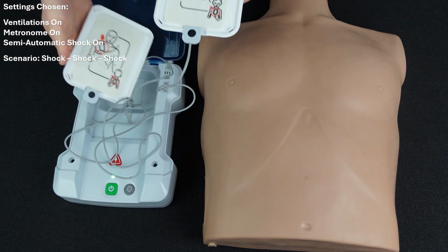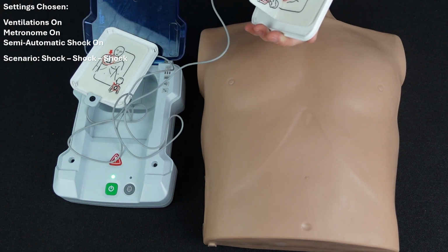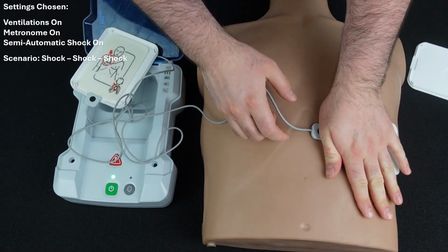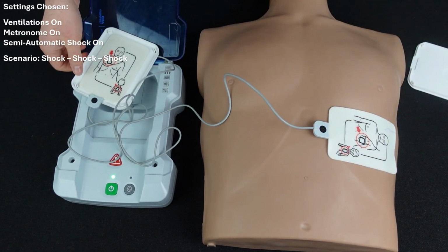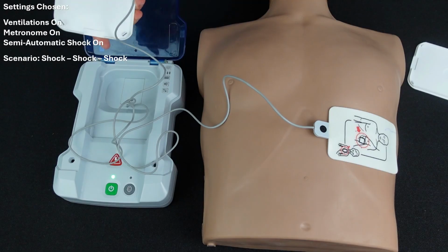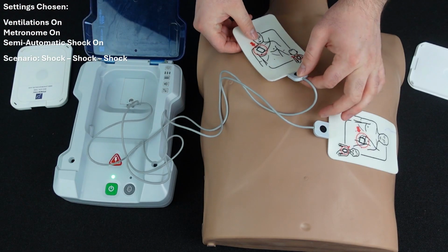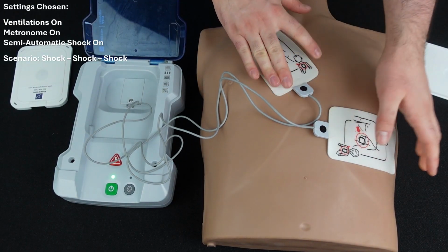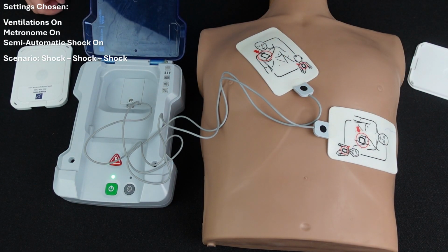Place the pads on the patient in the correct orientation as indicated in the picture on the pads. The trainer will not continue the training scenario unless the pads have correctly adhered to the mannequin's skin. Once the pads are in place, the trainer will automatically move on to analyzing the patient. If a shock is advised, then you will be told to stand clear. Press the red shock button as indicated by the trainer if semi-automatic shocks are on. If no shock is advised, the trainer will move straight to doing CPR.